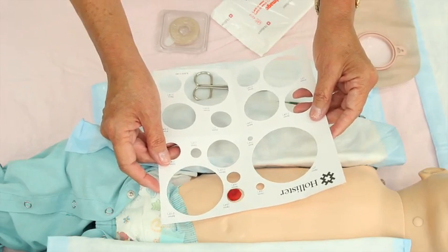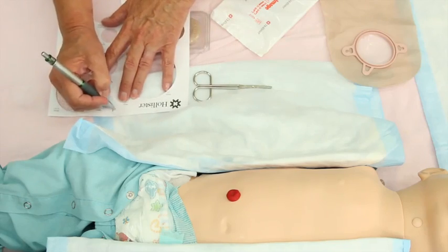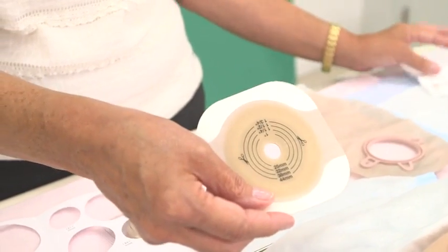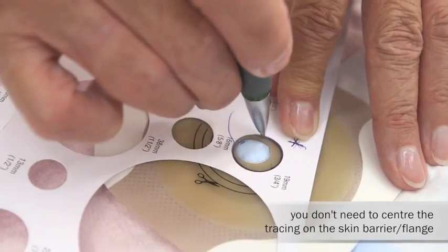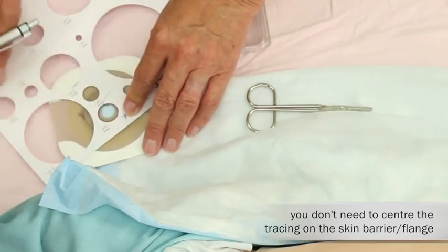Every box of appliances contains a measurement tool. Measure the stoma using the guide. Trace a circle on the back of the skin barrier or flange. Remember that not all stomas are perfectly circular shaped. Trace the actual shape of the stoma. It does not necessarily have to be put in the center of the skin barrier or flange.